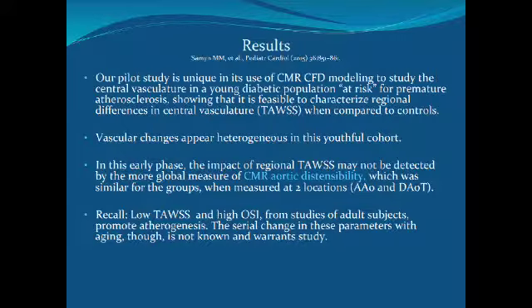So our results: our pilot study is unique in that it's the first time CMR CFD modeling is used to study central vasculature in a young diabetic population who's at risk for premature atherosclerosis, showing that it's really feasible to characterize regional differences in the vascular parameters of time average wall shear stress. They appeared to be heterogeneous changes. In this early phase, the impact of regional time average wall shear stress may not be detected by the global distensibility marker that we had, because that really wasn't any different.